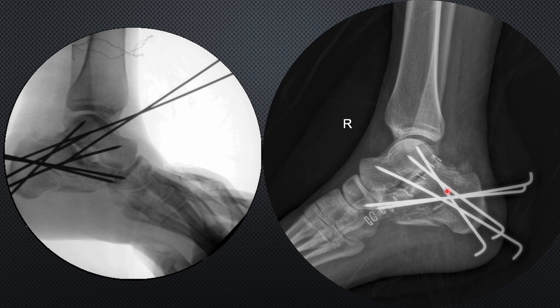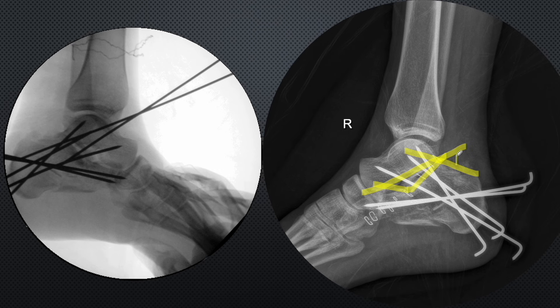This is the post-operative radiograph. You see the area of the skin incision and the articular reduction appears good now. All the angular parameters are good. This is the Gissane angle — this is the anterior process and this is the alignment of the posterior facet — it is good. If we draw the Bohler angle, it is now 30 to 40 degrees, which is the normal value. The Gissane angle varies from patient to patient and the key thing is to verify that the articulation is correct.